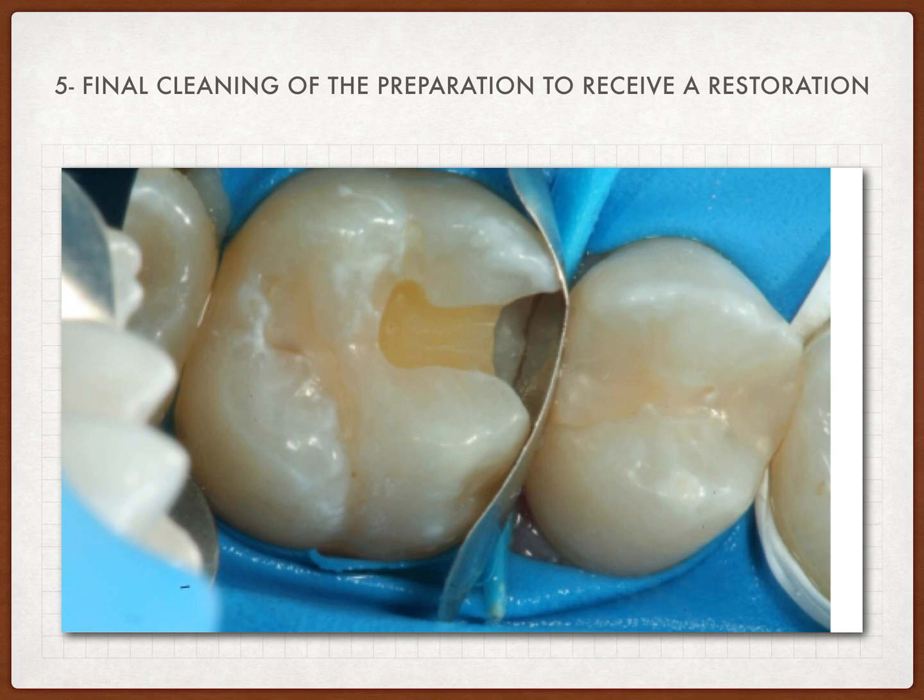The last step or principle in the tooth preparation is the final cleaning of the preparation to receive the restoration. This is of course very important because it will prevent the unnecessary debris or bacteria, the debris that will jeopardize the retention of the restoration to the tooth.